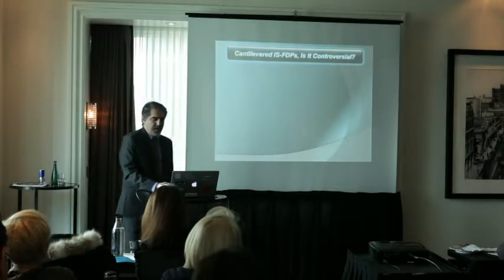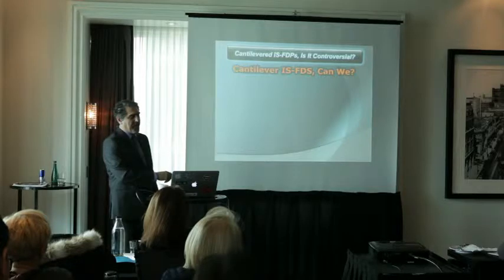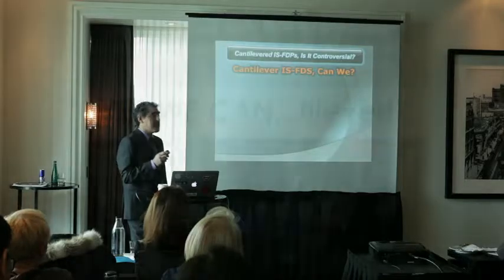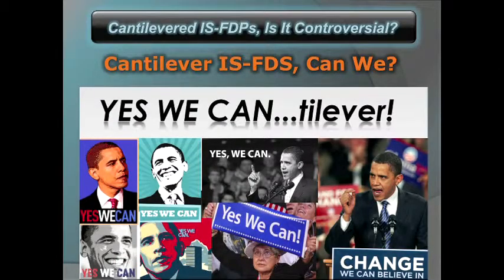Okay, so now let's have a conclusion on this topic, cantilever. Can we? Yes, we can. Definitely we can do it. And in many cases, it would simplify the treatment. It will make the treatment more affordable for the patient, and in many cases it will avoid more complex, complicated, less predictable, huge grafting treatments, and we can take advantage of that.